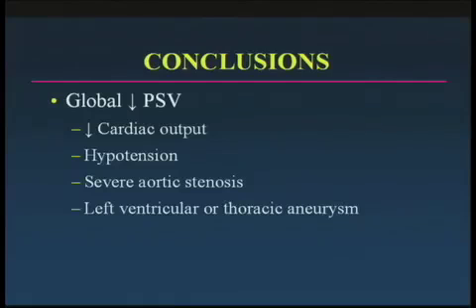Well, I hope I've convinced you that carotid ultrasound is exciting and that it is useful clinically, and I hope that the things that I have learned over the years will help you and your patients in your practice.